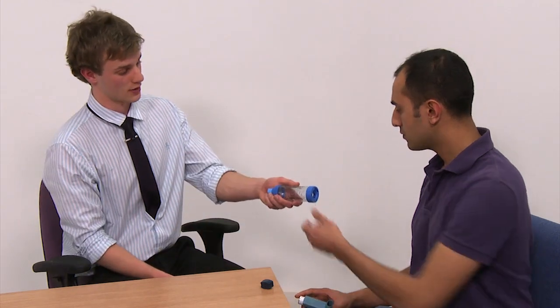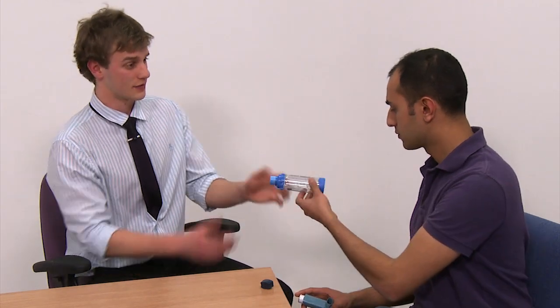So now I'm going to explain how to use your aero chamber. This is very similar to what we just did. Just as before, make sure you're sitting up nice and straight. Take the cap off both the inhaler and the spacer. Slot the inhaler into the spacer, and then give the whole thing a shake, about four or five times.